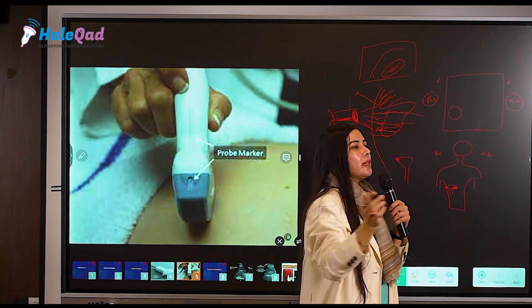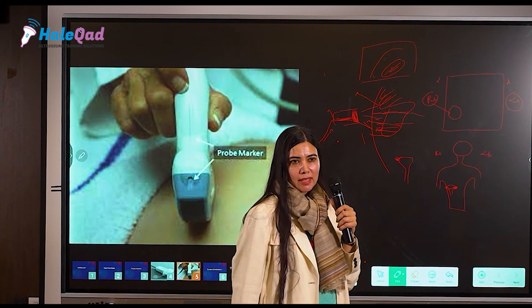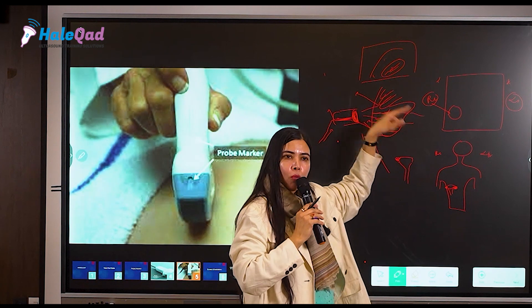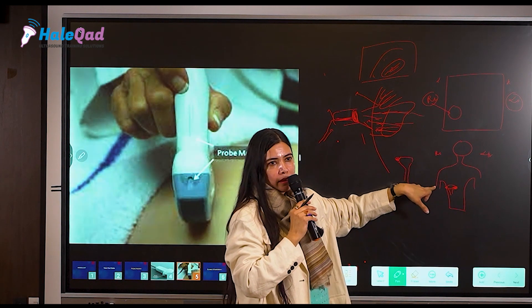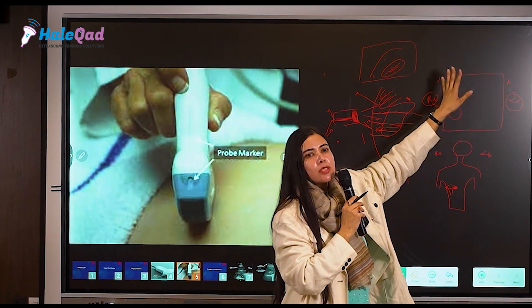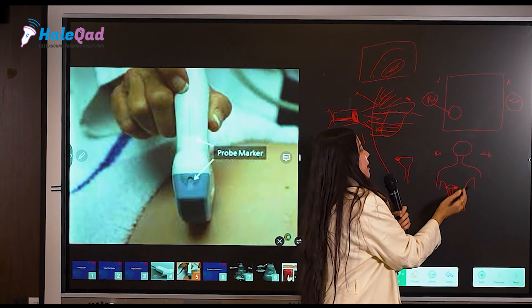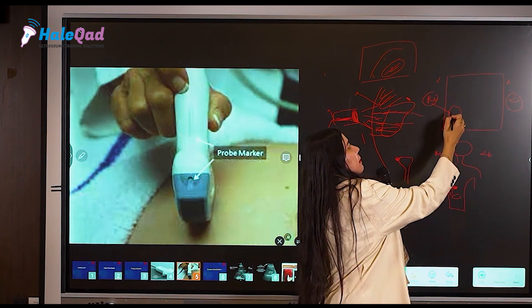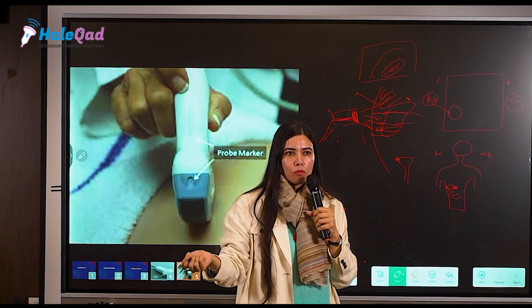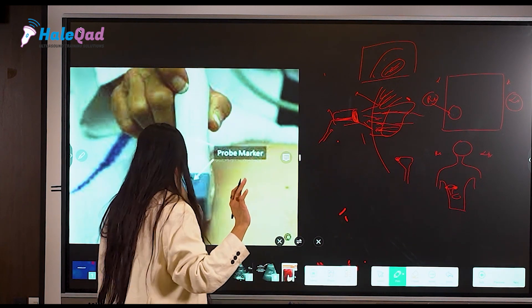The scan was done abdominally and the cyst was on the left side, but the doctor assumed by default that whatever is on the right side of the screen is always the right side of the patient — which is only true if your probe marker is on the right side of the patient. In this case, the probe was held improperly, so the anatomy got changed. The cyst was on the left side only, but due to the incorrect probe position it appeared on the right. This is the importance of the probe marker.